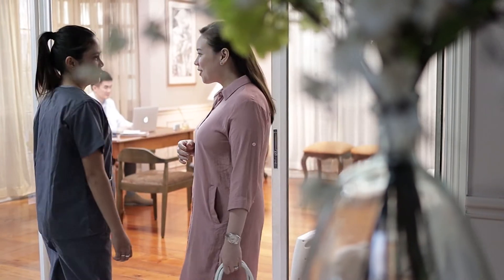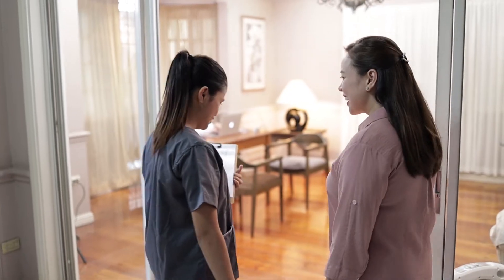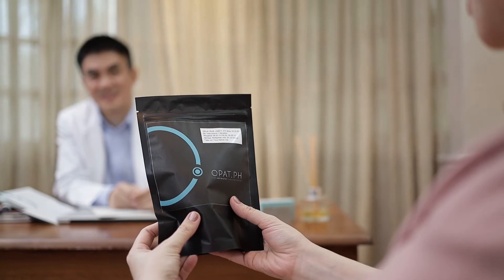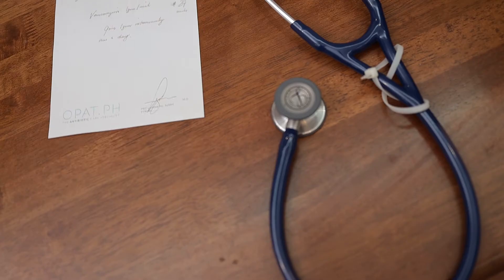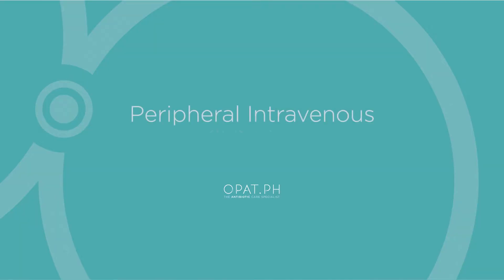The antibiotic treatment intended for hospital confinement can now be done at the comfort of your own home. To begin your medical journey as an OPAT patient, we will now provide you with a step-by-step guide on how to administer your antibiotics using the elastomeric pump via the peripheral intravenous or IV line.